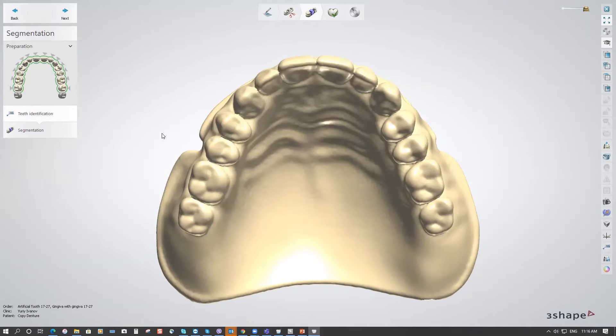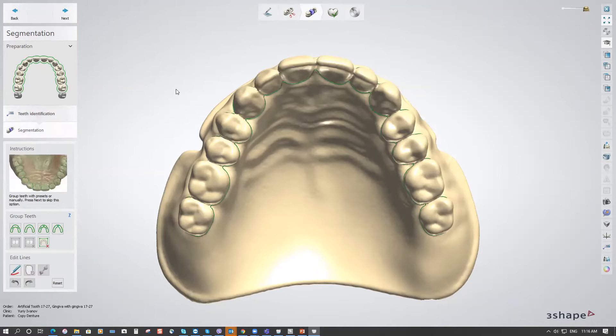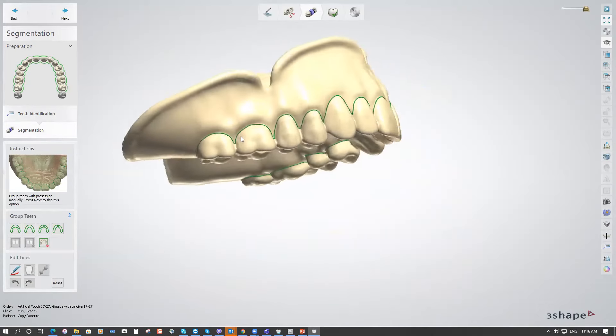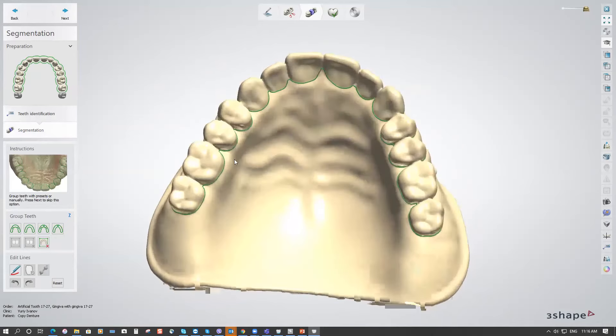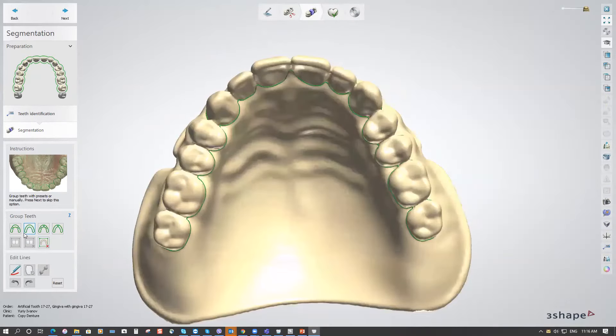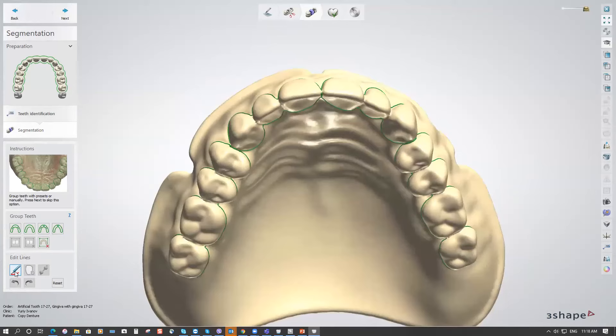Click Next for segmentation — it is done automatically by the software and you can see a green line all over the teeth. You'll see there's an option to group teeth; it was set to the second option: one bridge. You can also split them into two, three, or four bridges, and you have the option to modify the segmentation line.